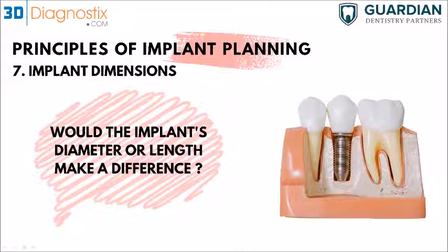Awesome. And say if I'm doing an anterior case and I want to expand the bone or osteodensify it, same thing. Initial positioning and then take out the surgical guide and do it manually or freehanded. Yeah. So either you're using the Versah guided kit. Yes. Yes. If you're not, then you're going to have to do that.